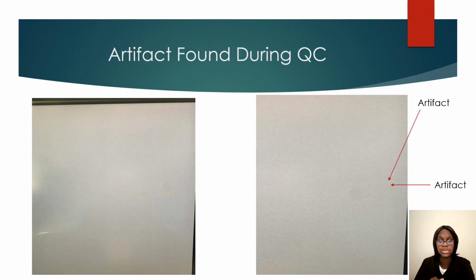Whenever I was doing this, one day, my coworker who was also doing the QC on the same day in a different room, she found this artifact. It's very small. To see this, you also have to have the zoom feature selected to see small artifacts like this.